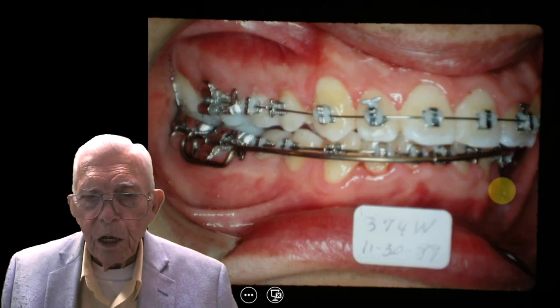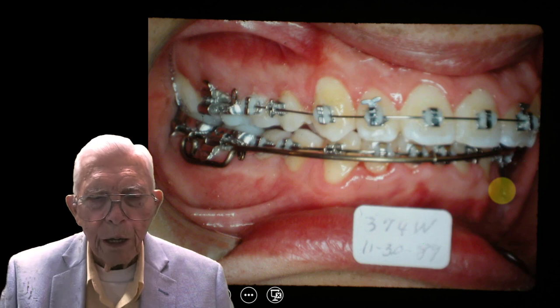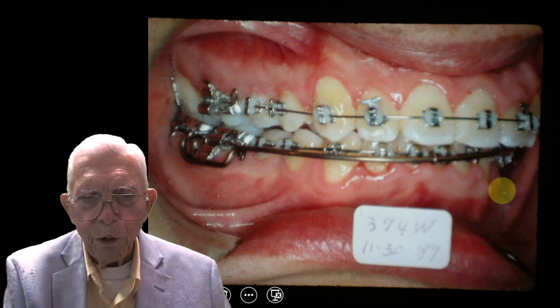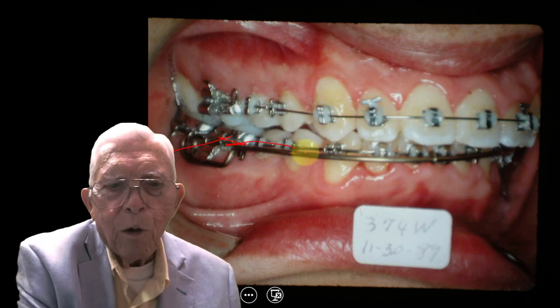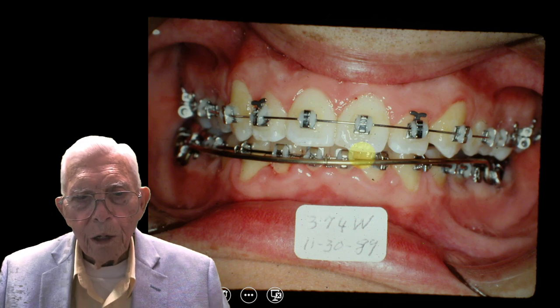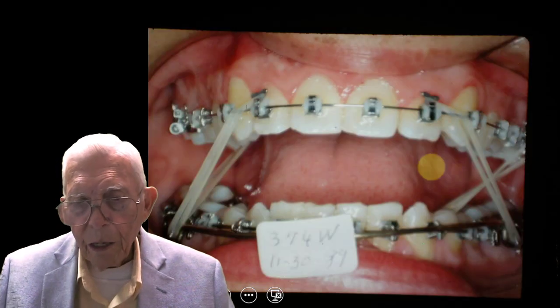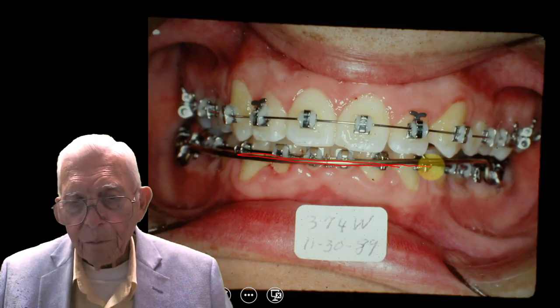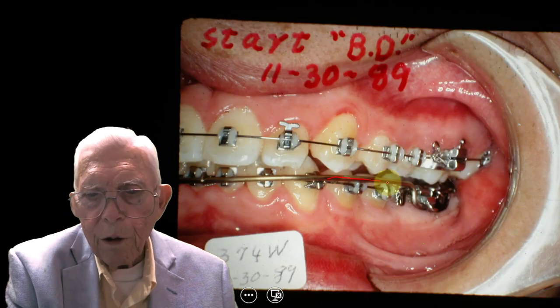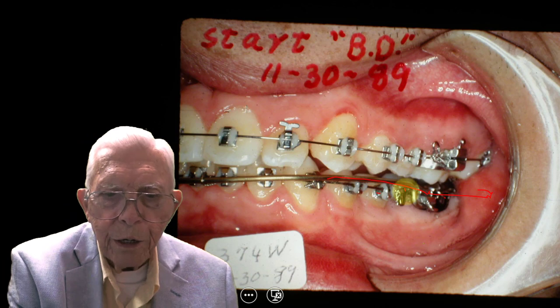We use a large arch wire we call a big daddy arch wire. If you put this on anybody, you can expand their case with one of these wires. You have it built out way past the arch and you pull it in and wire it to these teeth. On the other side of the mouth, where we really want expansion — looking at it straight on — it doesn't do much out here, we just tie it up. This wire right here is way out past the teeth. We push it in and tie it to these teeth.